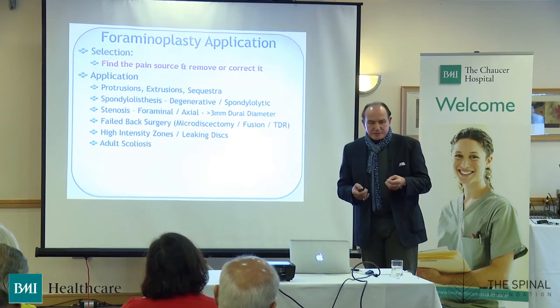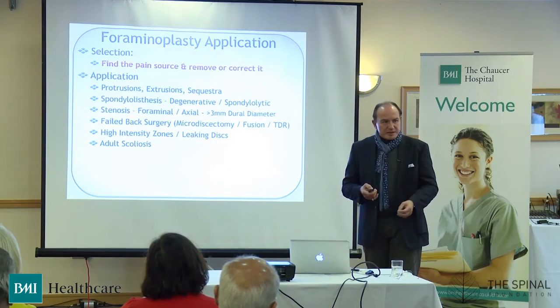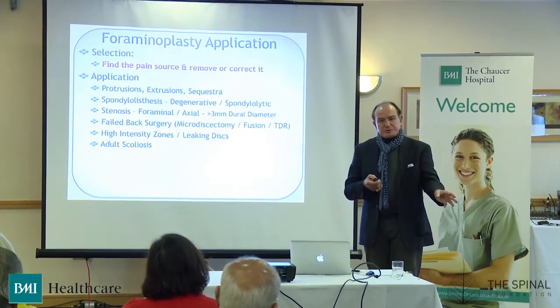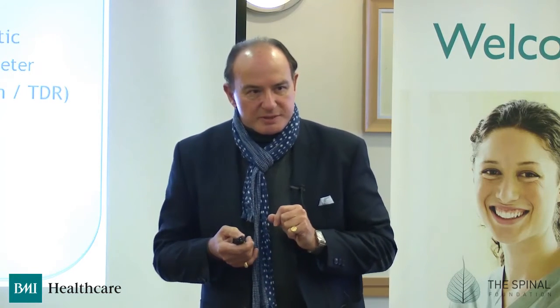If you've got a sizable recurrence, you can go back in through the side door, go into the side of the disc, take out the disc protrusion and get out through the side door without having to traverse the epidural space and all the scarring that will be there.